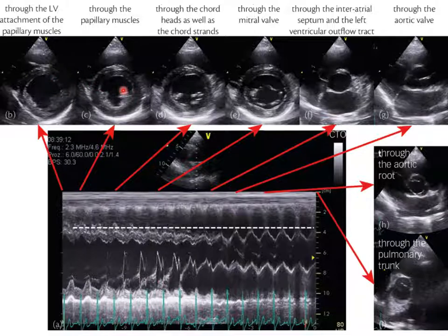And then they're going to tilt the transducer such that they eventually point in the direction of the valves. There's the aortic valve. So I'm sitting here, point the transducer at the middle of the left ventricle, then I tilt it until finally I'm pointing up towards the valve plane. Right? And then what you can measure, actually simultaneous with doing this imaging, is the M mode plot of the central line through this image, right?